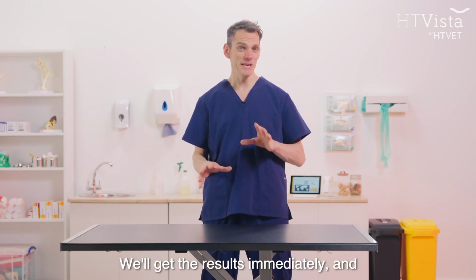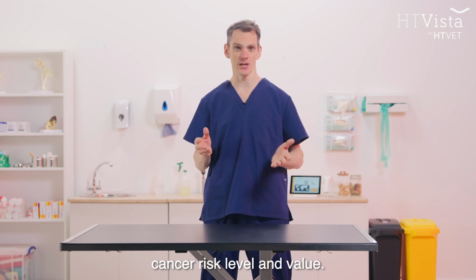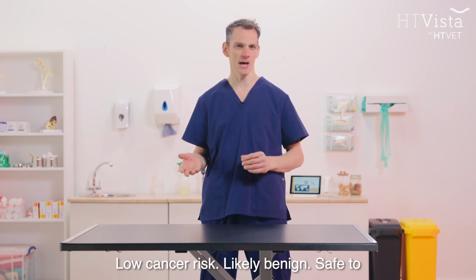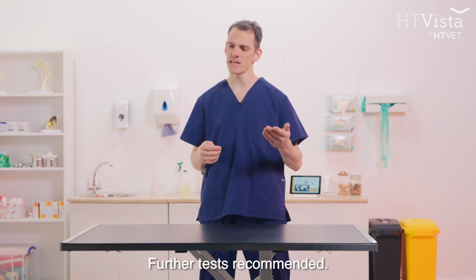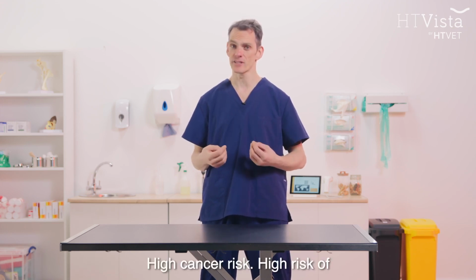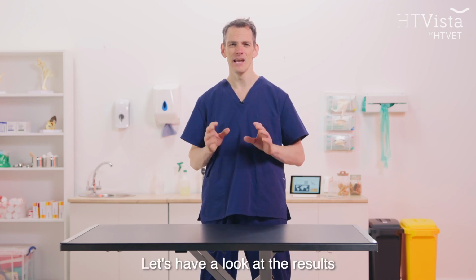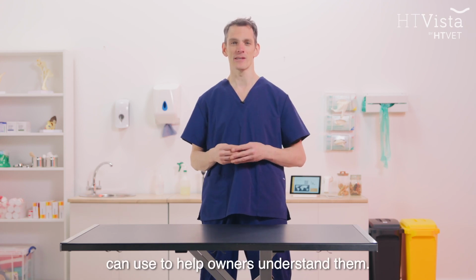We'll get the results immediately, and they're presented as a cancer risk level and value. This is based on the chances of the mass being malignant. Low cancer risk, likely benign, safe to monitor with routine follow-ups. Moderate cancer risk, further tests recommended. High cancer risk, high risk of malignancy, further tests required. Let's have a look at the results dashboard and show you the visuals you can use to help owners understand them.